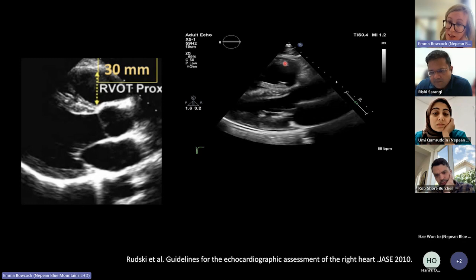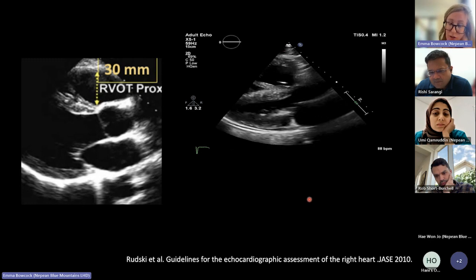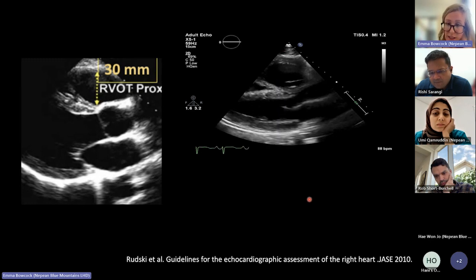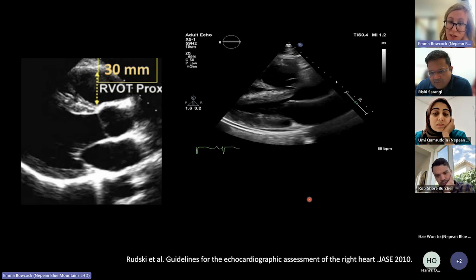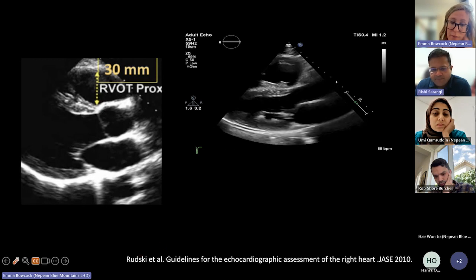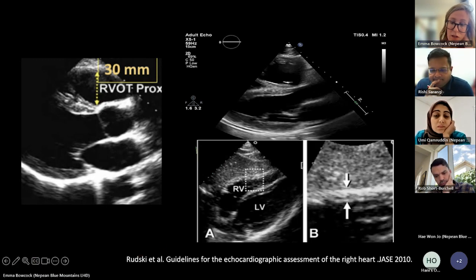Given that the RV looks thickened, it's dilated, and there's a really prominent moderator band, you'd then go through your whole thing of doing a full study, looking at the whole heart and seeing their clinical history, looking at old echoes. Are they known to have a history of pulmonary hypertension and things like that? But you're already starting to get a feel for what you're going to be focusing on just from your parasternal long axis view. Yeah, I'll just take that off.